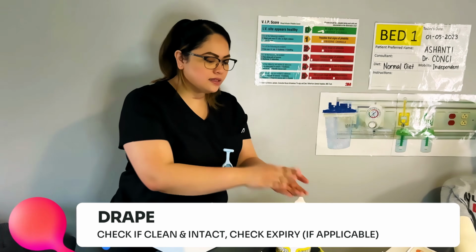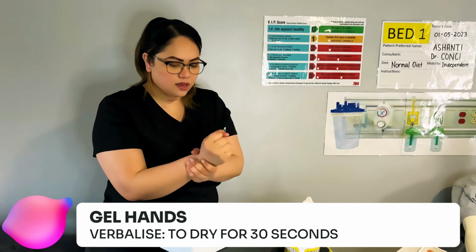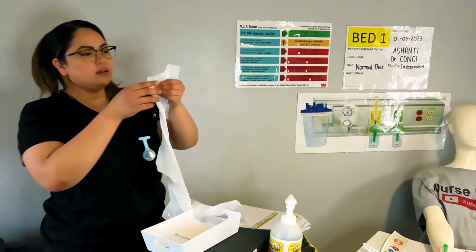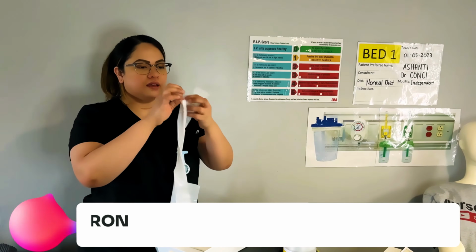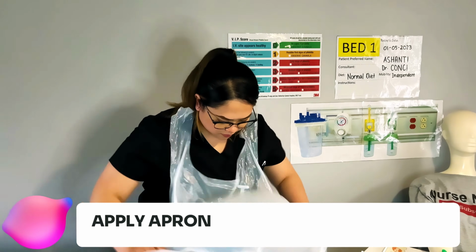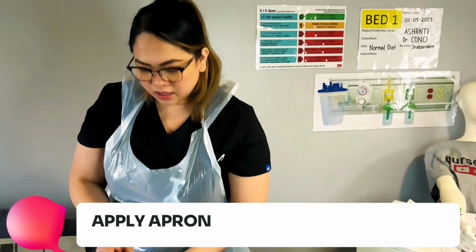So these are all the things that I need. I'm going to gel my hands and let it dry for 30 seconds. I've got here my apron. Get some gloves.